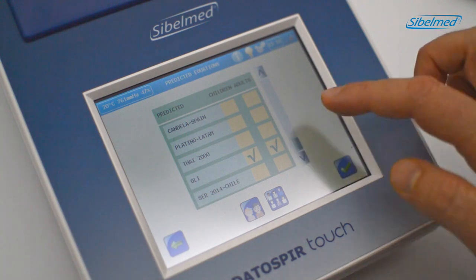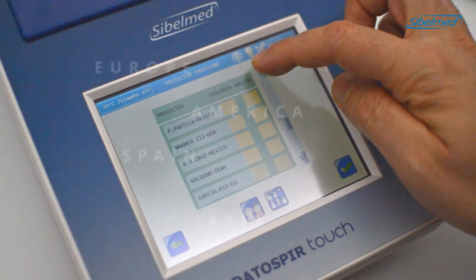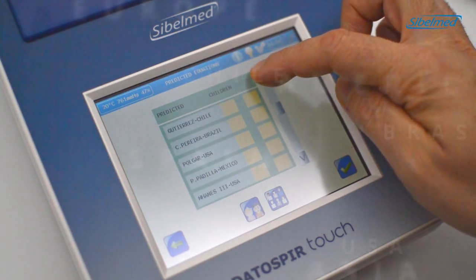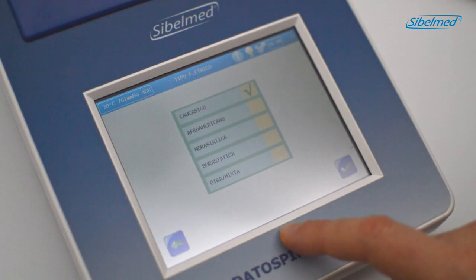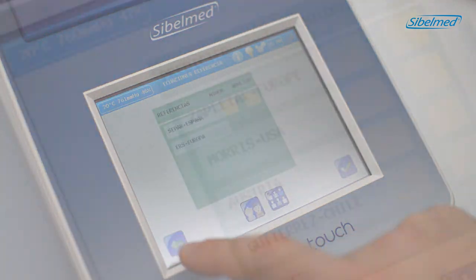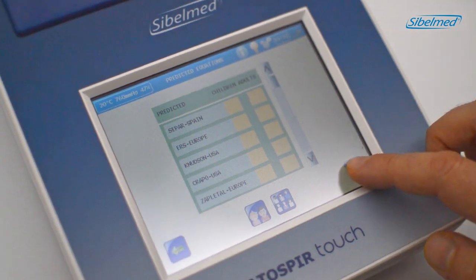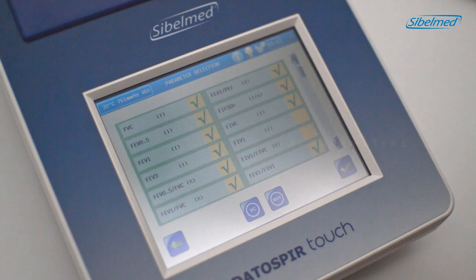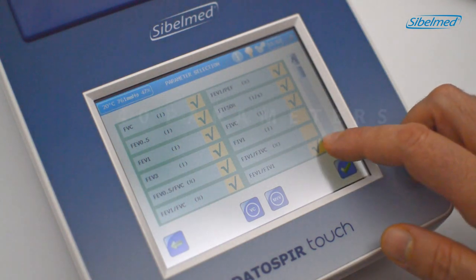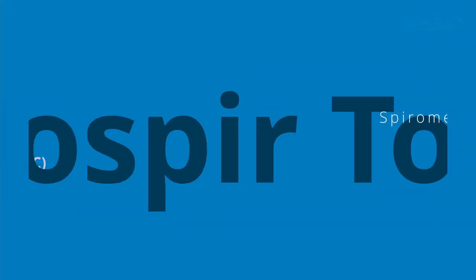Click on the icon to select the predicted values for adults and children. At the bottom we can select the ethnic factor or race, and we can see the list of the most important worldwide using the scroll bar. Let's see the list of spirometry parameters. We can enable or disable all the parameters we want to see on the display and printout. At the bottom, there is a filter to view the parameters by type of test: FVC, VC, or MVV.